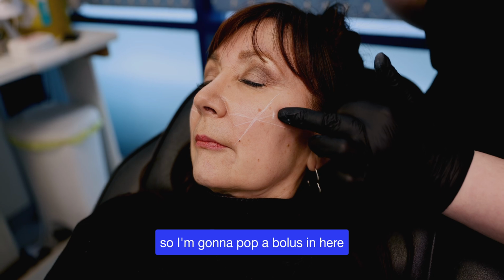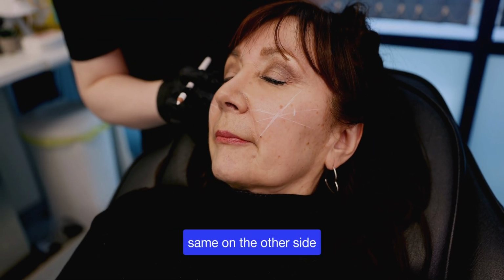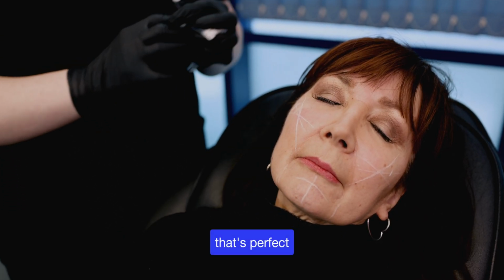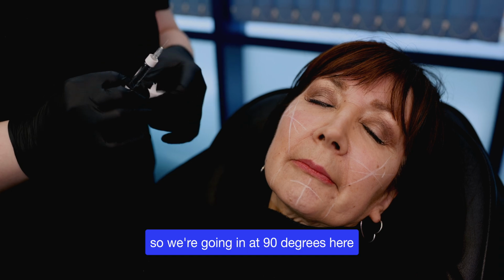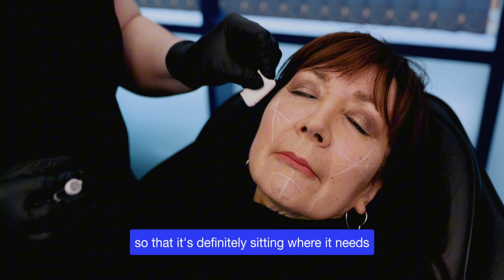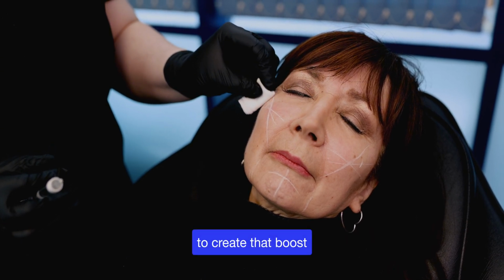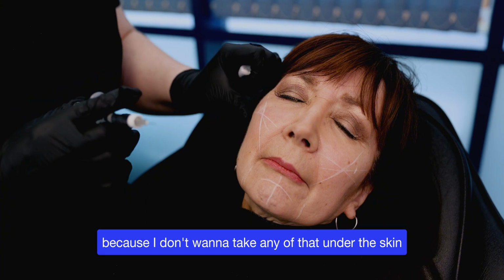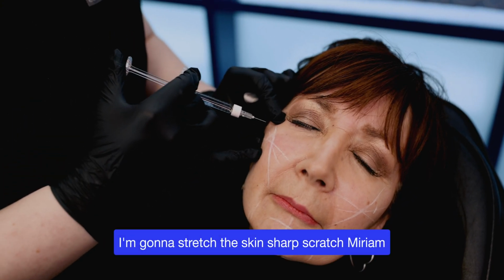So I'm going to pop a bolus in here. Same on the other side. I'm just going to push you to one side for a second. That's perfect. So we're going in at 90 degrees here. The tip of the needle needs to touch the bone so that it's definitely sitting where it needs to create that boost. I'm going to take away the white marking because I don't want to take any of that under the skin. I'm going to stretch the skin.